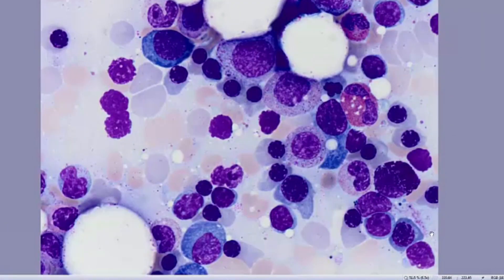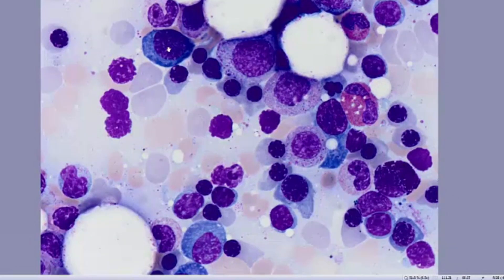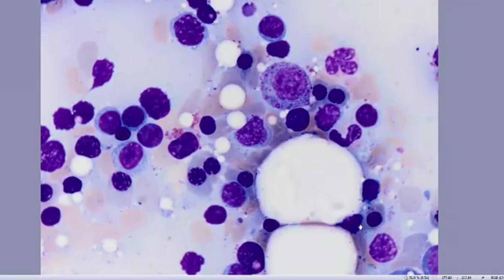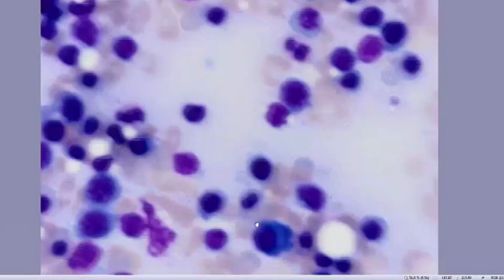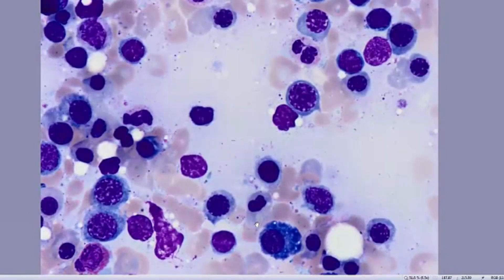This is a view of the aspirate smear under oil magnification. You can see there appears to be a preponderance of erythroid elements, or a reversed myeloid-erythroid ratio. You can see erythroids of all stages, including early forms. There are definitely some nuclear irregularities in the erythroids as shown here. In this field we see a number of erythroid elements maturing normally, and the myeloid series appears to show normal granulation. Here we also see a binucleated erythroid cell.